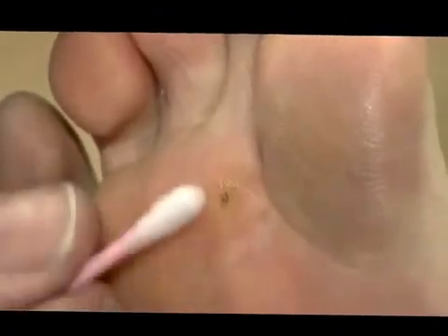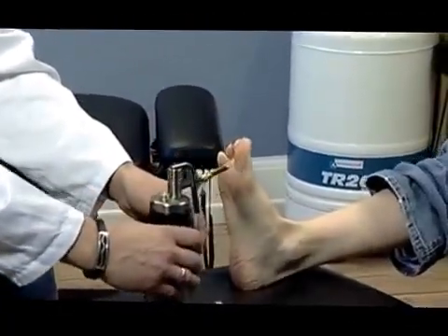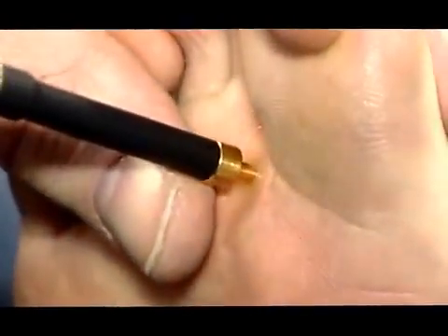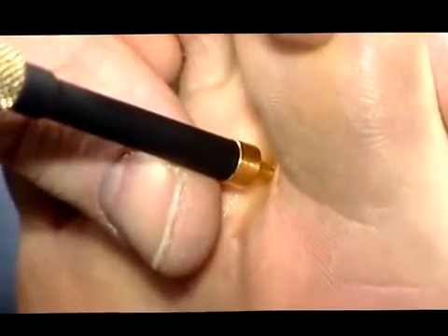Moisturize the treatment site with a drop of gel or a cotton bud soaked in water. Then apply the probe while it is still warm without pulling the trigger. With the probe in place, pull the trigger.